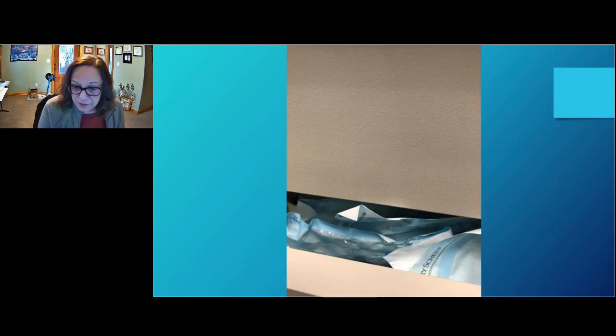So I just wanted to point this out to you to show you that when you store sterile items in a drawer, it's not like putting your underwear in the drawer, and if they get caught, oh well, you just stick your hand there and fix it. With sterile packaging, again, you don't want it smushed, squished, compressed in any way, mushed up.